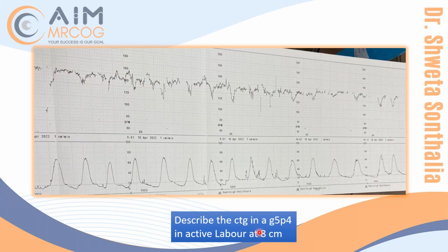That's it. These are the real CTGs. This is not for teaching purpose. So this is not fabricated. What kind of deceleration she is getting? Again. Variable. Early, early. No, they are variable, definitely.